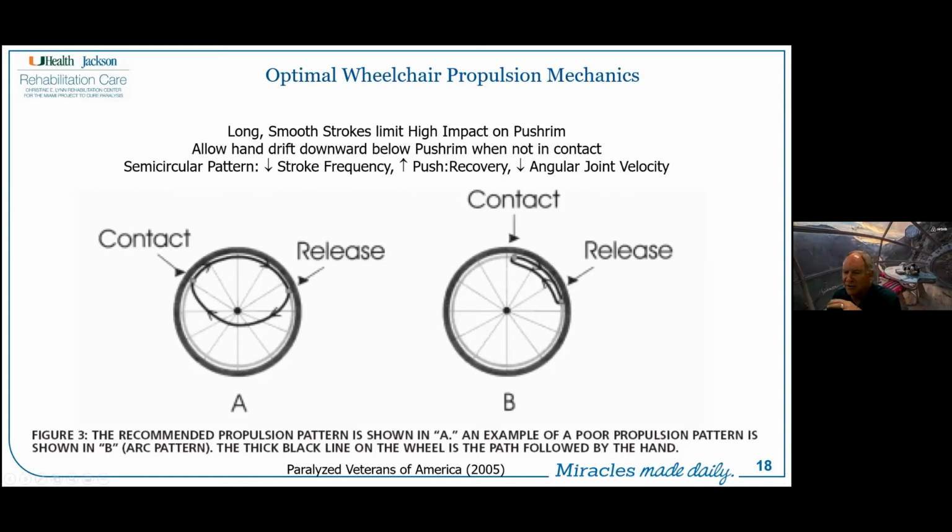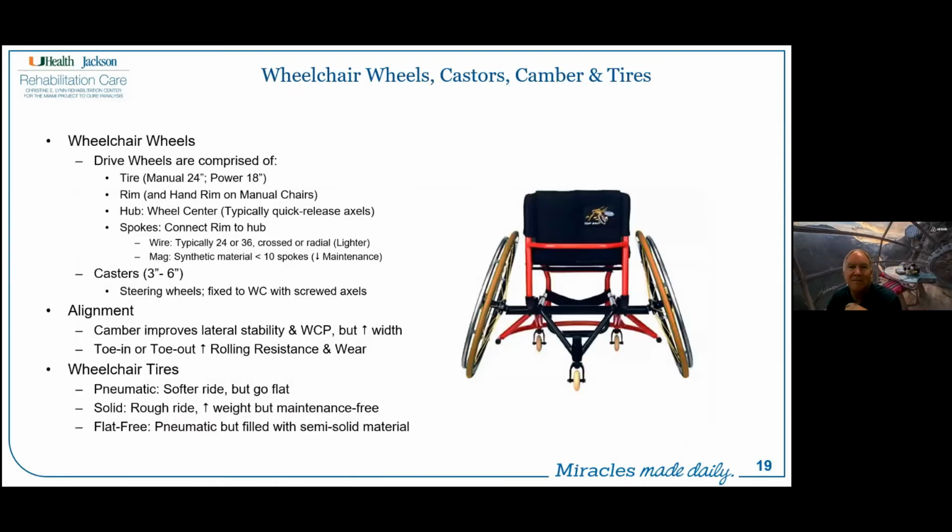So these are all things that you want to keep in your mind as you're putting together the prescription for, oh, did I mention an ultra lightweight wheelchair? The other thing to consider, and I'll bring this in now, is what kind of wheels you're going to use and what kind of biomechanics you need to have with regard to the push rims.